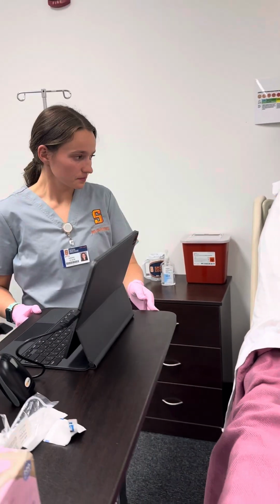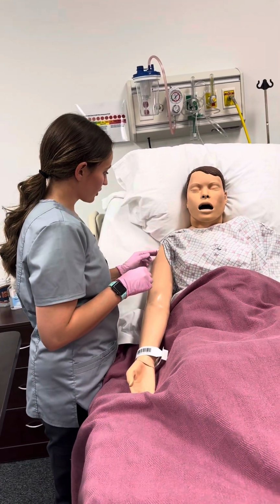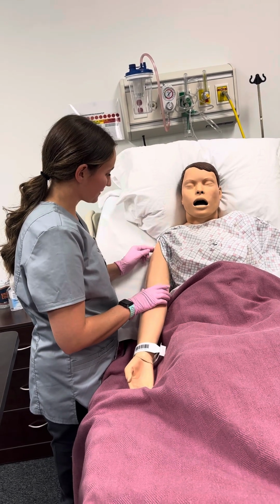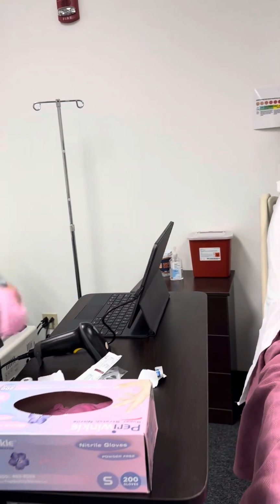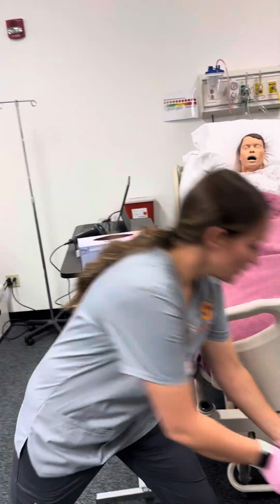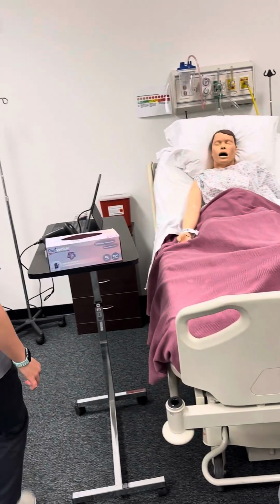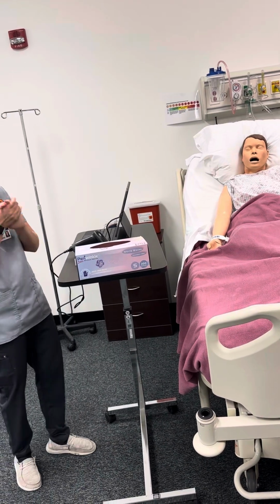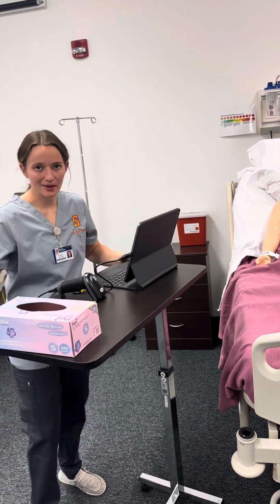Okay. How did that feel? I'm gonna put this gauze on for a second. Are you doing okay, Jonah? Okay, perfect. Okay, so then I'm gonna take this off, throw all this stuff away. Take off my gloves and hygiene. Okay. And then since the medication is administered, I did my 3 checks, my 6 rights.